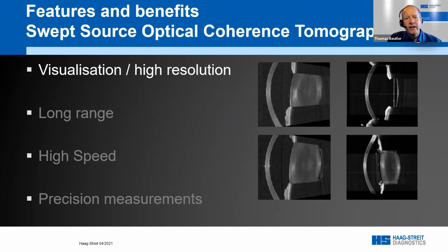And on the bottom right, we have, again, a phakic patient, so we have the crystalline lens still in place, but we do have an ICL, which is, in this case, iris mounted, iris clipped on, and it's also on display. So we have nice visualization of the entire anterior segment of the eye with all details.